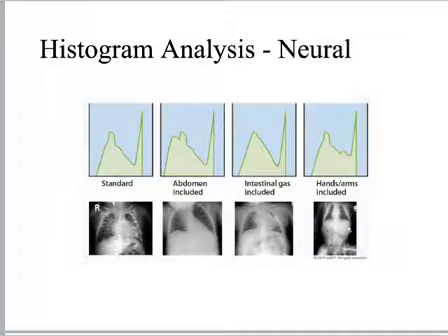This is also true for radiation therapy. If as you're shooting your portal images, it is defined, I'm expecting to see a portal image for a prostate, right? If it doesn't get a portal image for a prostate, guess what? The histogram's going to be thrown off, and you're going to be really craning to try to see it. And I don't even know how to begin to correct those errors on portal imaging systems. I know how to do it on computer radiography, but not on portals.